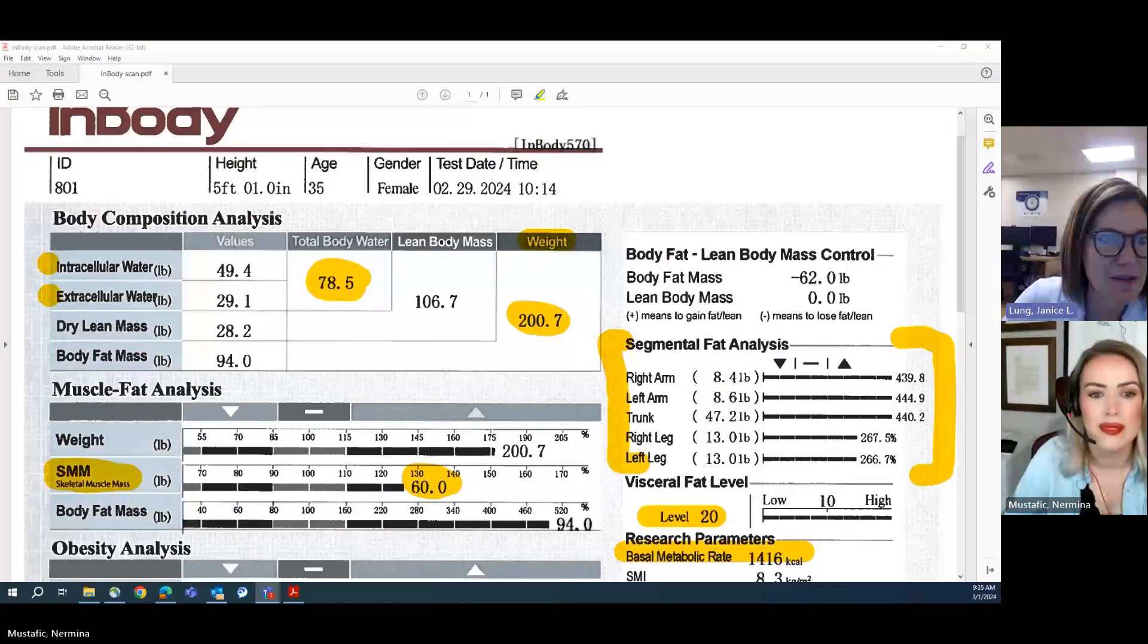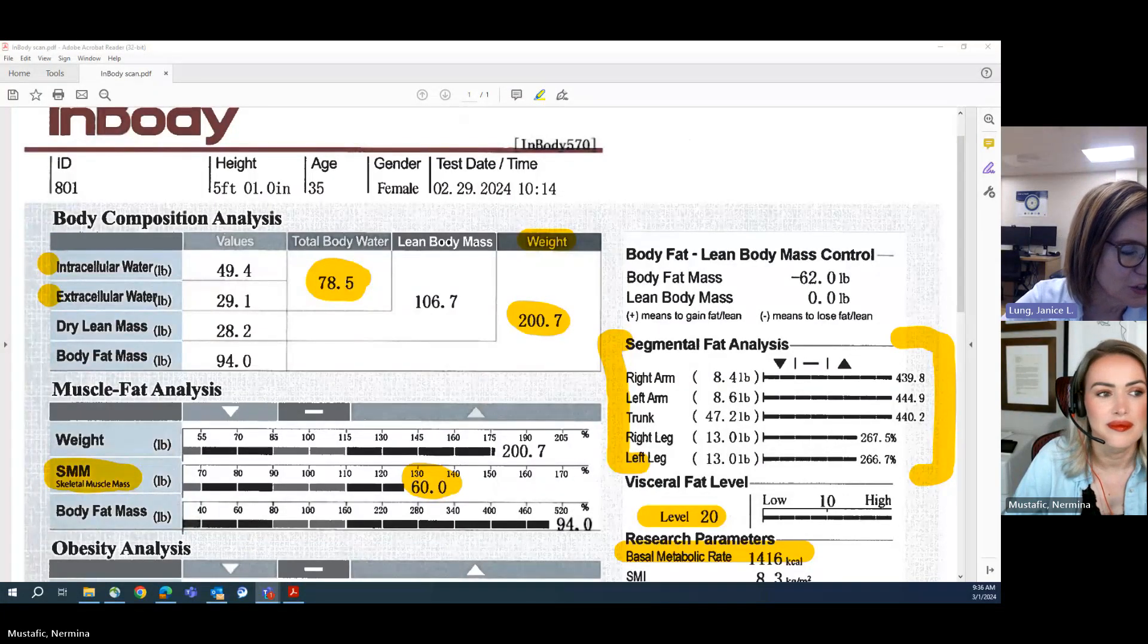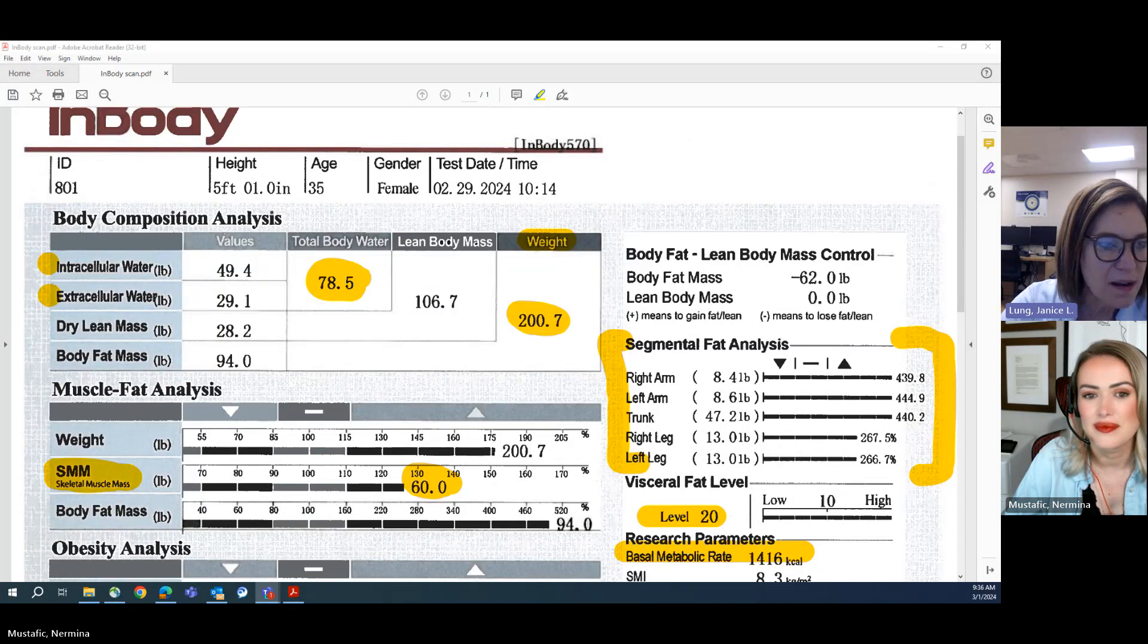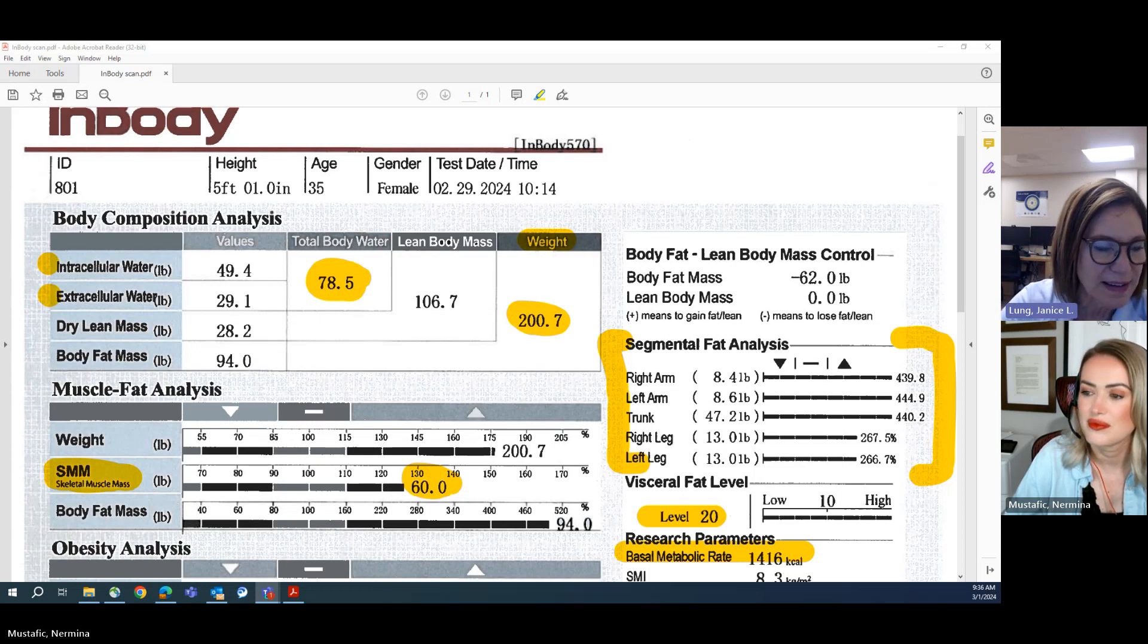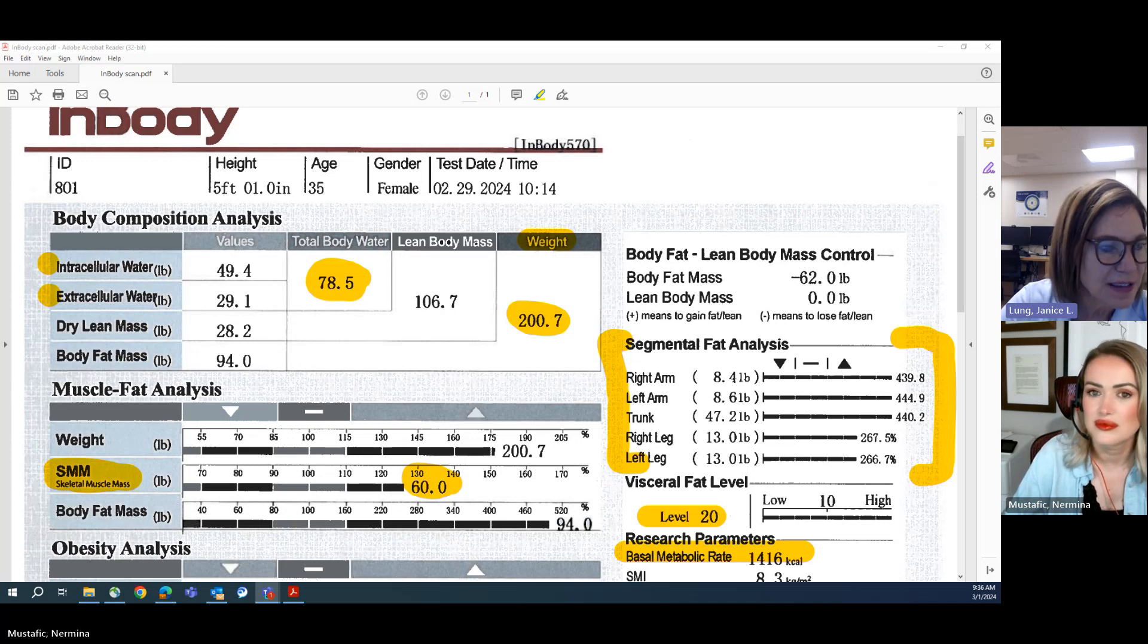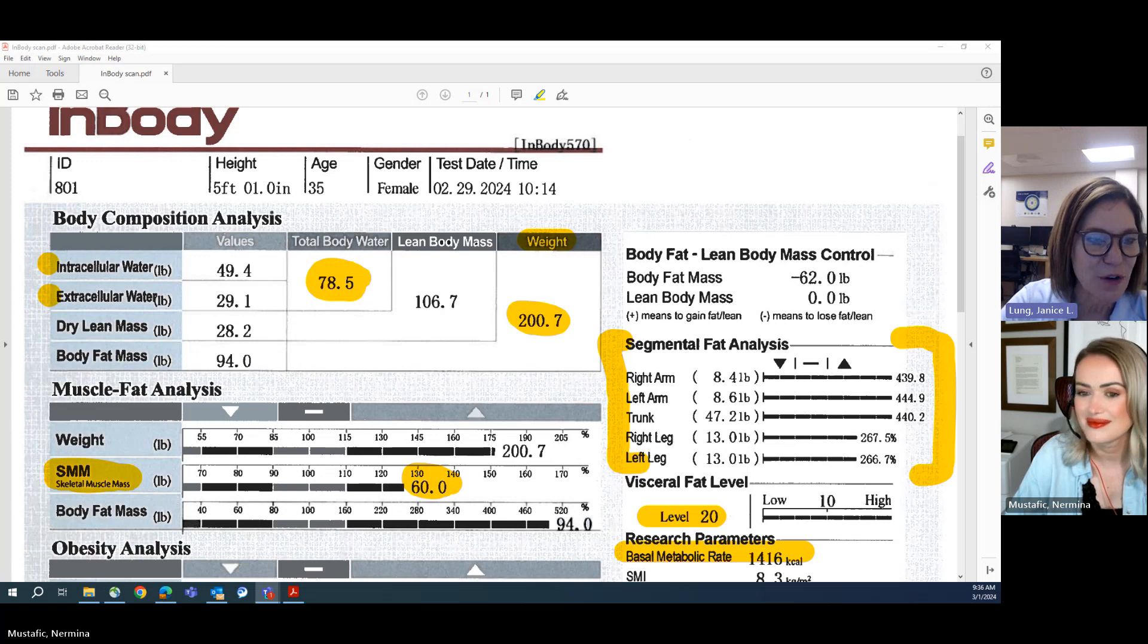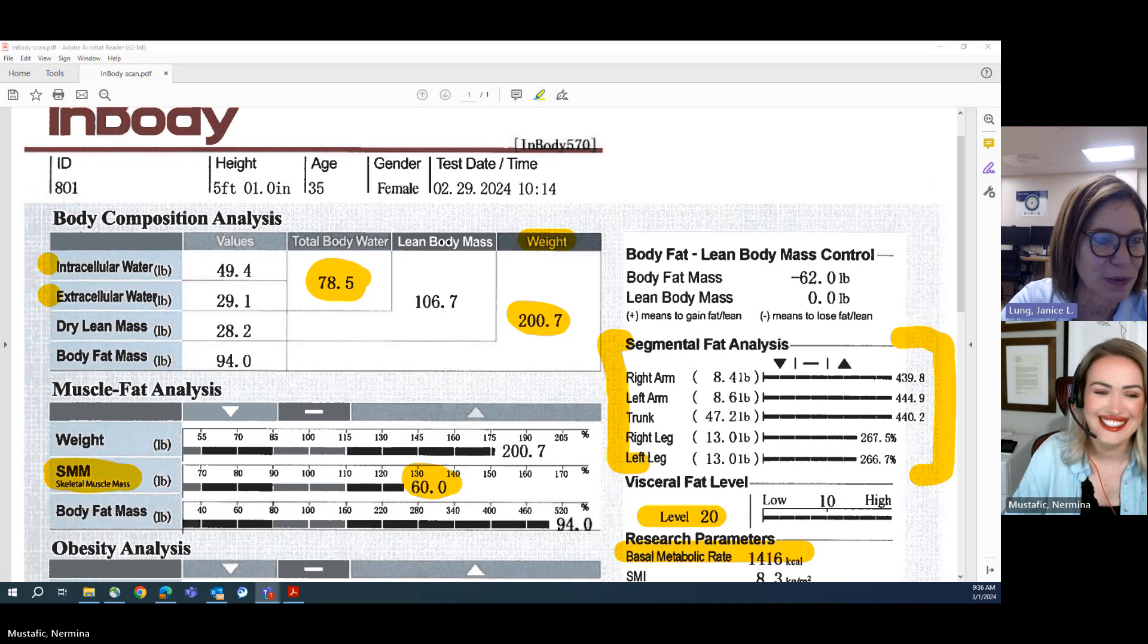For somebody here at the VA, what an awesome result sheet it is at first glance. One of the things that stands out in my mind is that we see this person's weight is 200.7 pounds. That's often the first thing that we look at when we step on the scale, and it's the least interesting information and the least useful information on this result sheet.